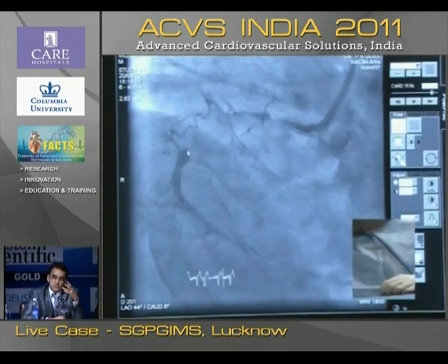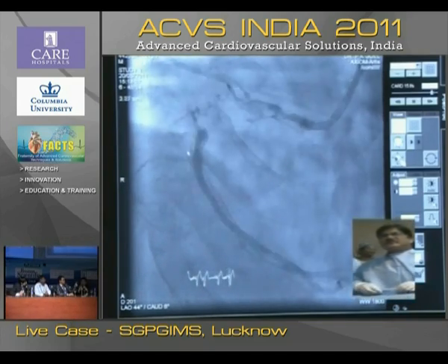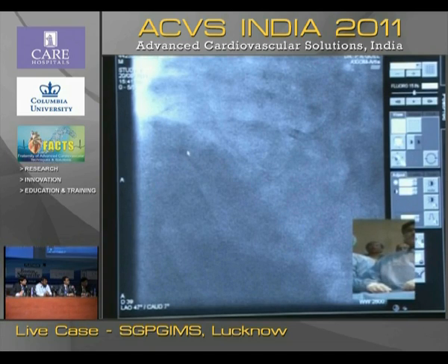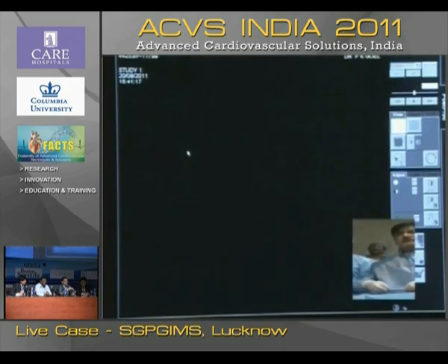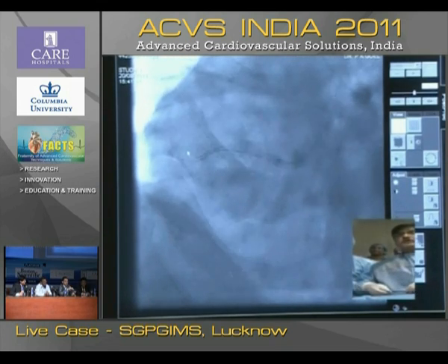Who's speaking? Any comments from the floor? Angio, show the whisper angio. Yes, run it. Now, Dr. Bansal, now it is too late. He has already stented twice, and you know, Dr. Goel is in a mood to go ahead.